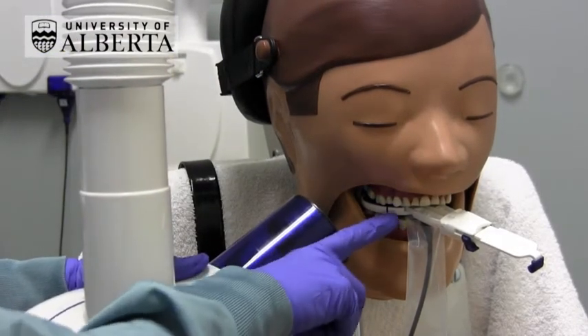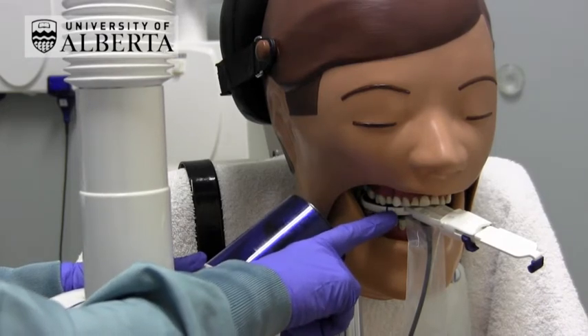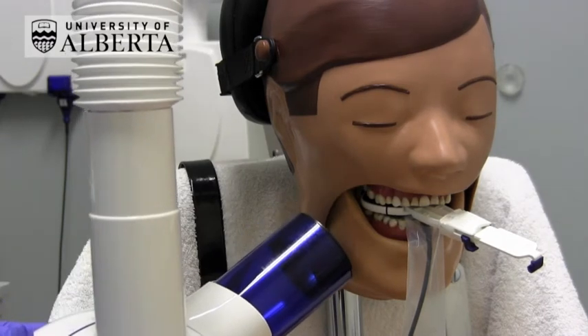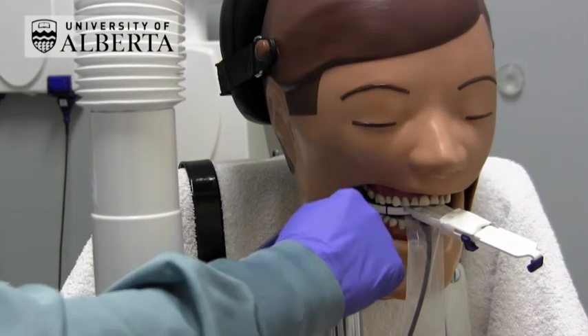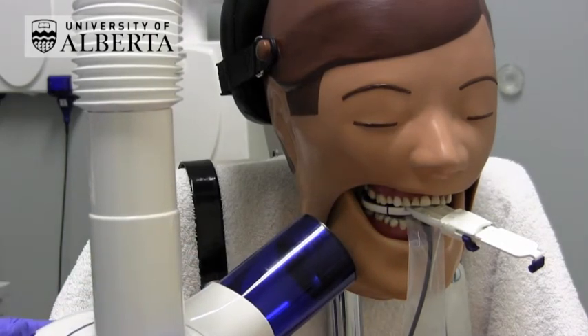Then align the BID so that the front edge of the BID is just level with the blue line on the bite block. This time you want the majority of the BID to be below the bite block and only about a quarter of the BID to be above the bite block.